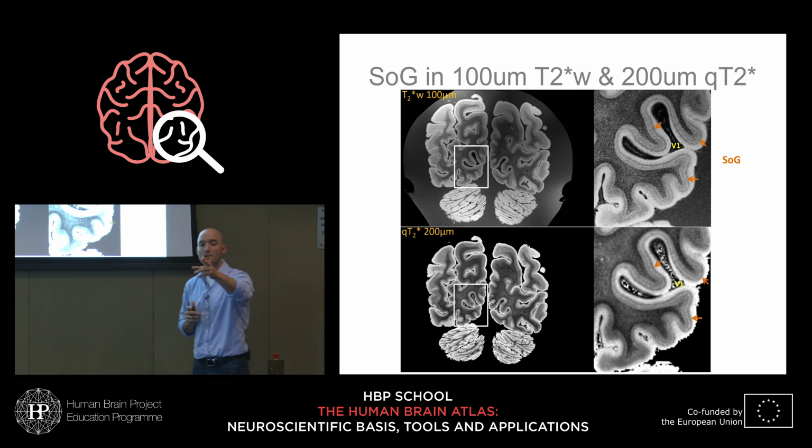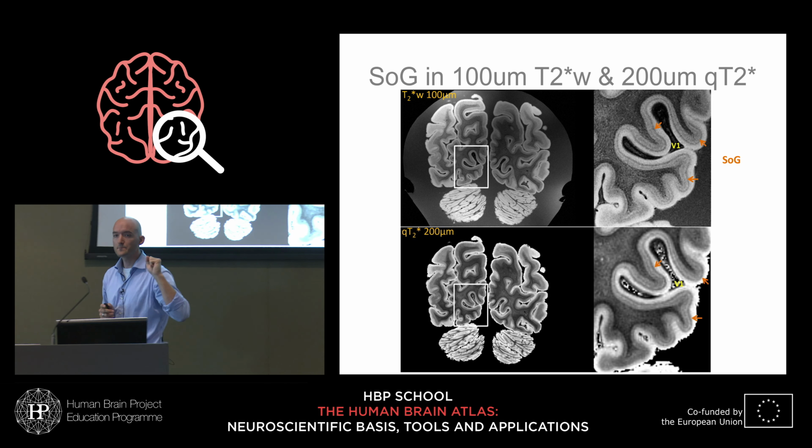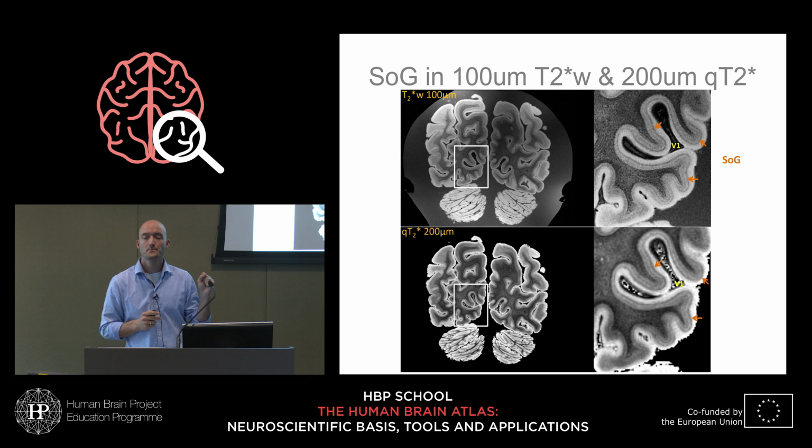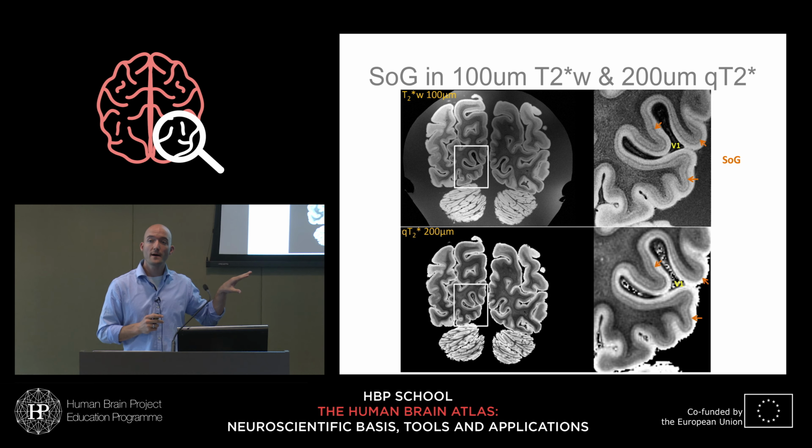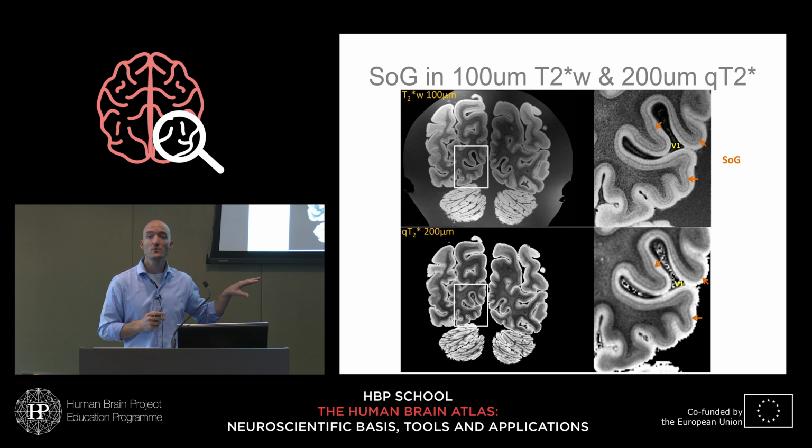Have you combined any of these approaches with Nick Weiskopf's in vivo histology approaches for the multi-contrast imaging? Yes, we have. And in fact, we also do Nick Weiskopf's contrast ex vivo. That focuses especially on, for instance, T1 contrast. In our experience, ex vivo T2 star contrast is easier to get to, better to model quantitatively than T1 contrast. So yes, as a short answer, yes we do, although we slightly prefer the T2 contrast. And not all of the in vivo modeling frameworks that Nick does also work ex vivo. Same story. Not everything in vivo works that way ex vivo.